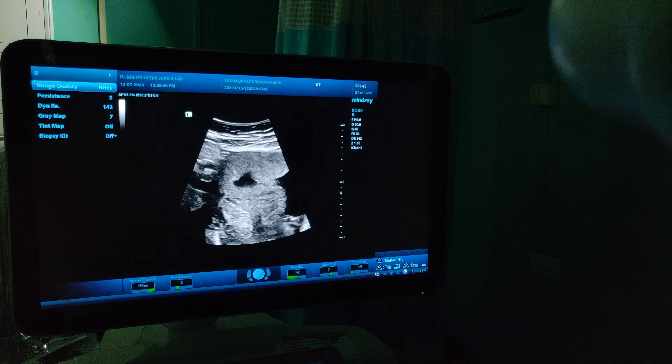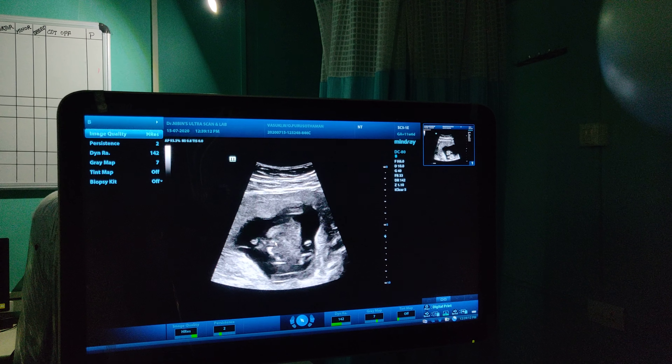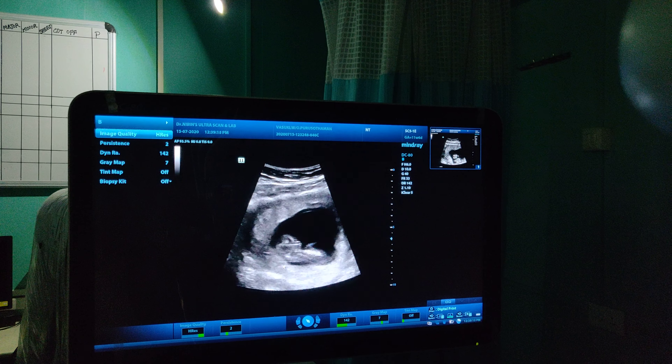So the NT Scan — the first protocol is to first see the placenta. Always start with the placenta. In this case the placenta is anterior. Once you complete the placenta, then you can go to the complete evaluation of the fetal body parts.